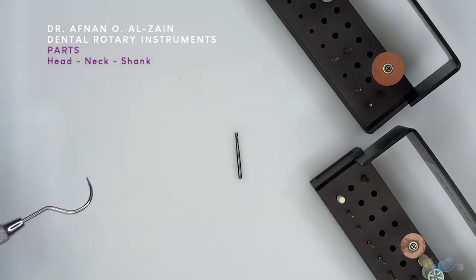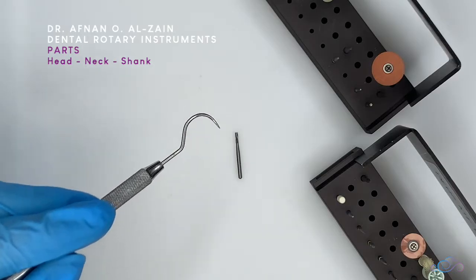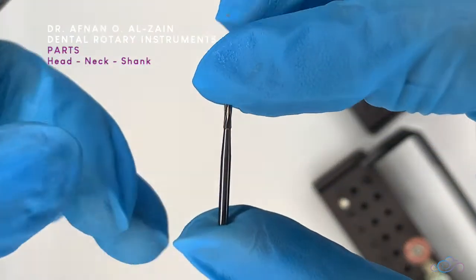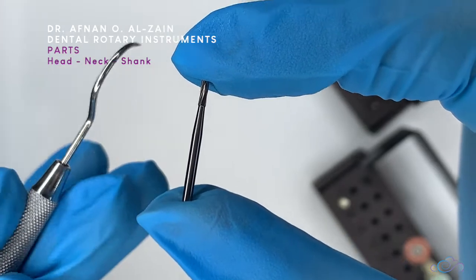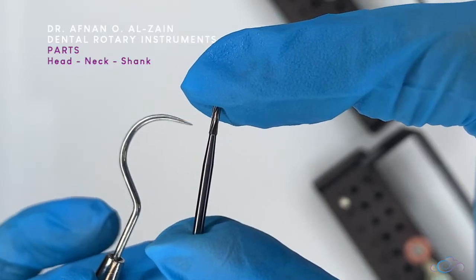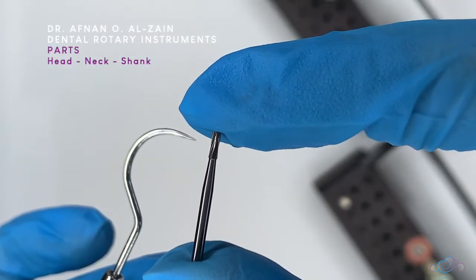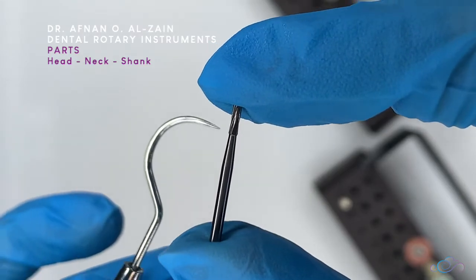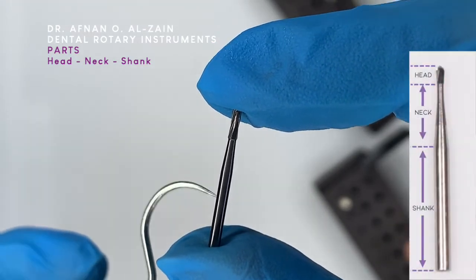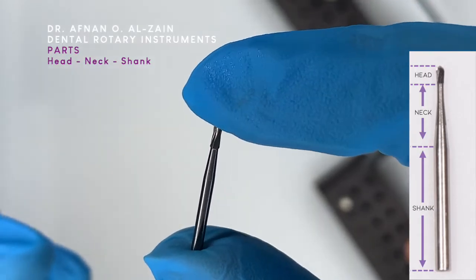First we will discuss the different parts of the rotary instrument. It's composed of different parts. The first part is the cutting part, or the part that has the flutes — this is called the head — followed by the neck, the part in the middle, and then we have the shank. So these are the three parts of the rotary instrument.